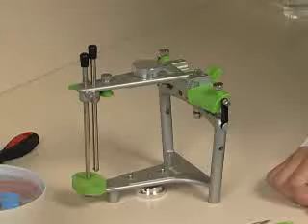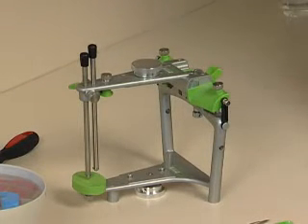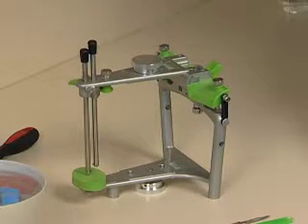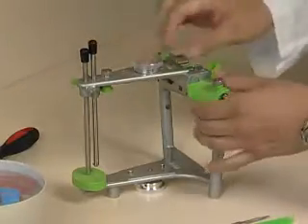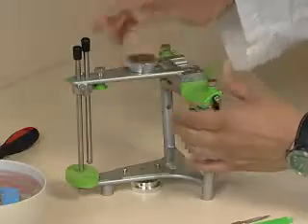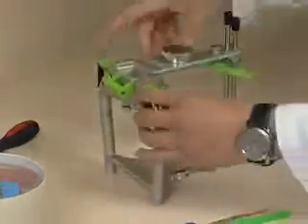Going to mount now the upper model, and I've recruited Dr. Jorge to help me with this. And so he's going to set up the articulator first to prepare to mount the upper model. And the first thing he's going to do is set the analogues at 45 degrees on both sides.